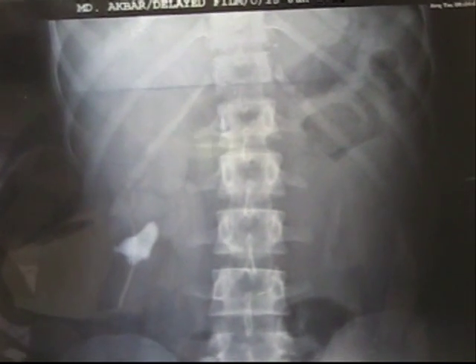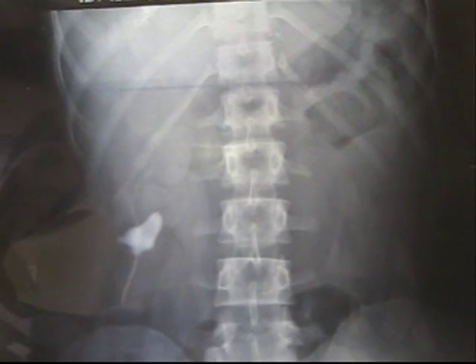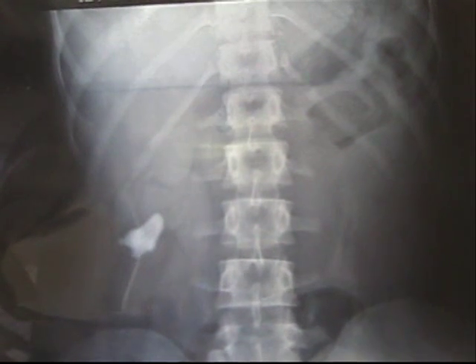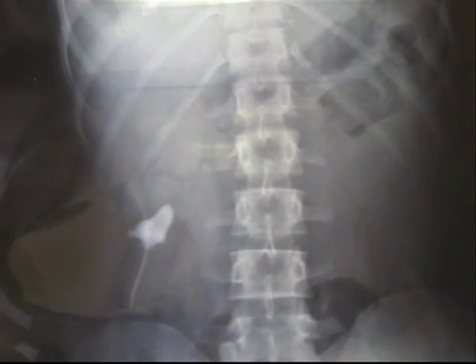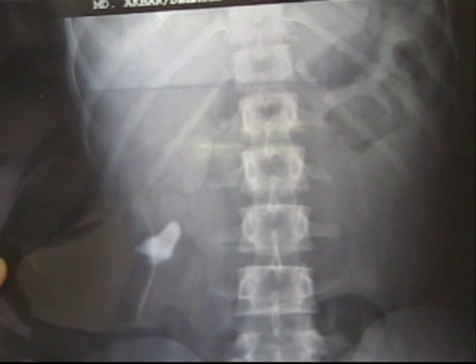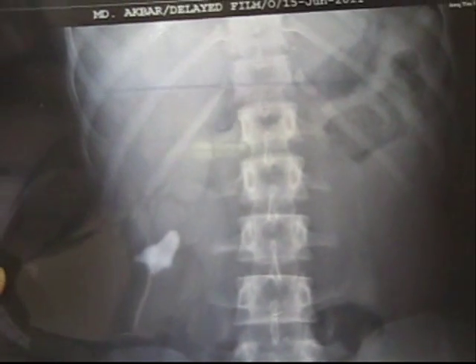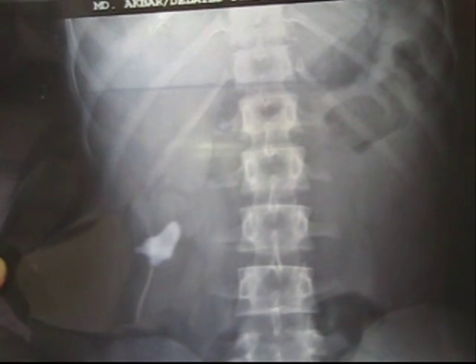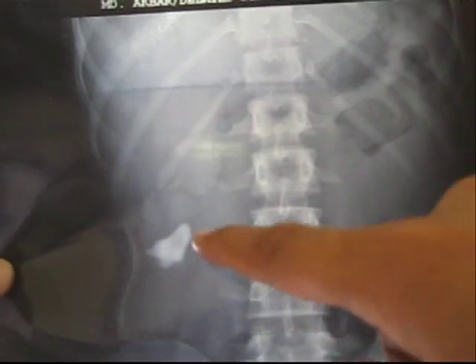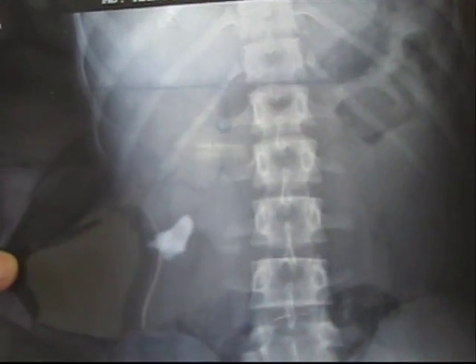This is a plain X-ray KUB region AP view. You can see a radio opacity at L3 level on the right side, which may be a staghorn calculus.